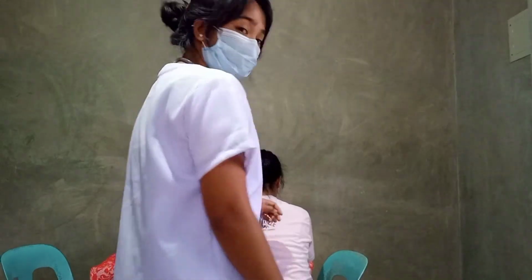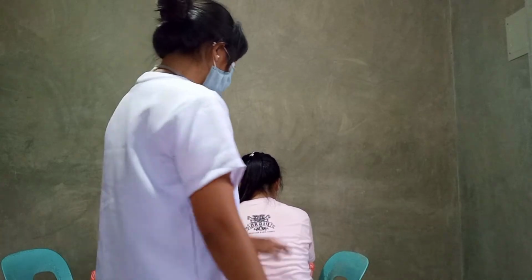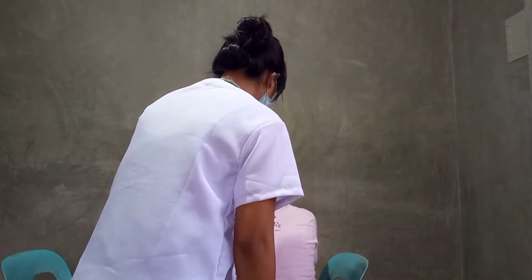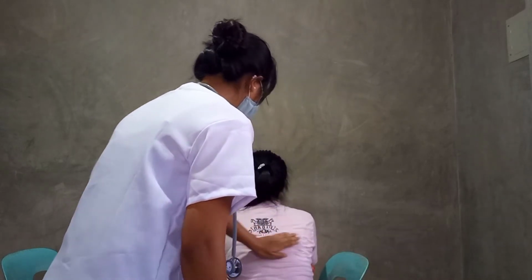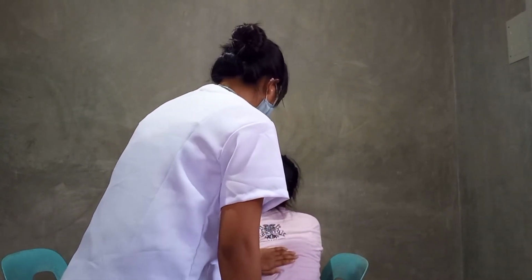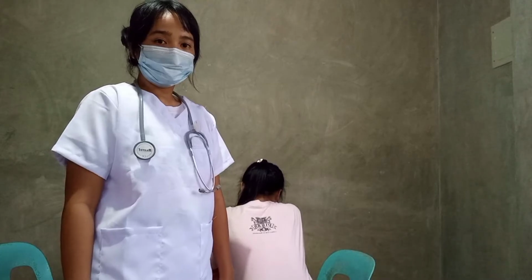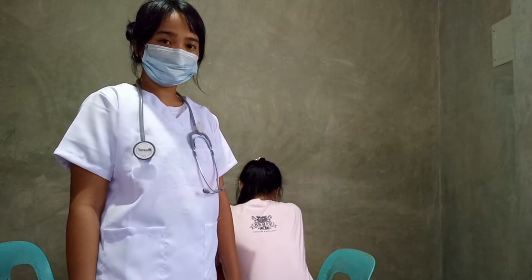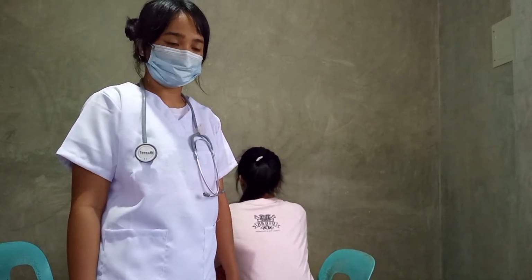Can you face here for a while? So we can now palpate the back. Breathe in, breathe out. We can now also proceed to auscultate the posterior thorax of the client for the lung sound.